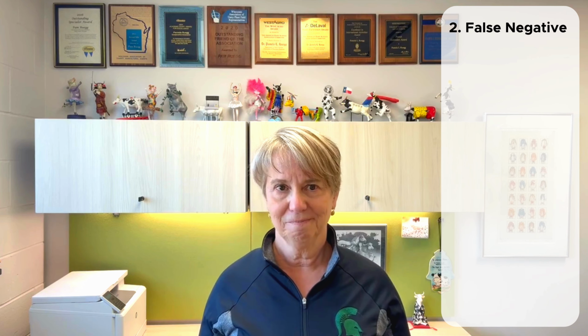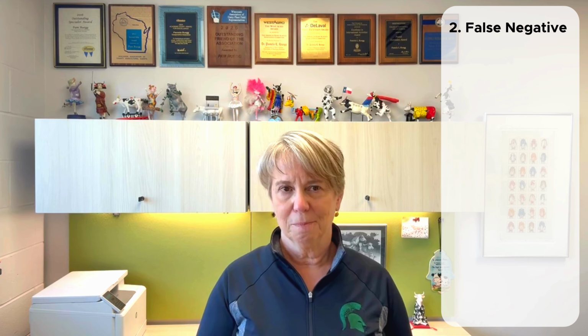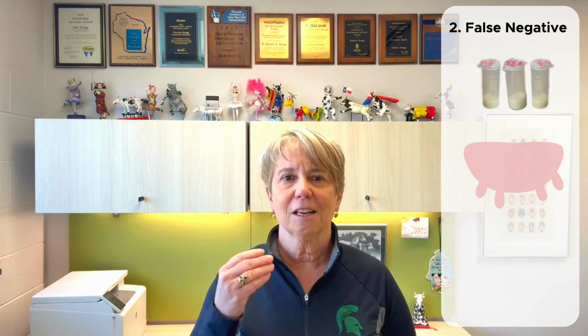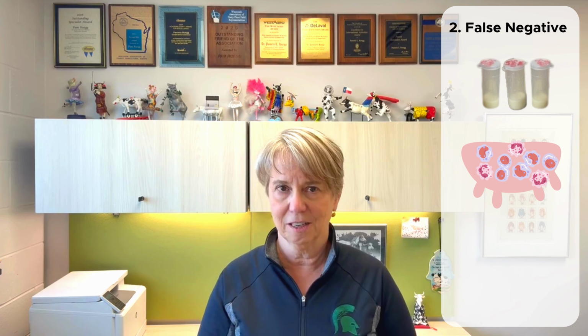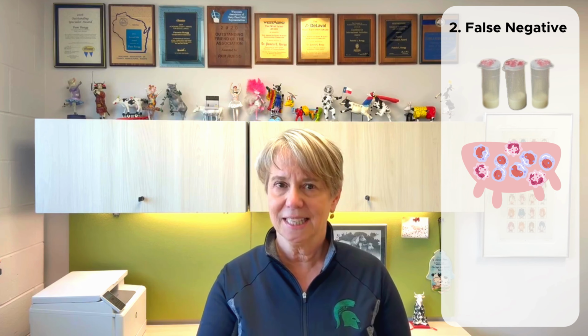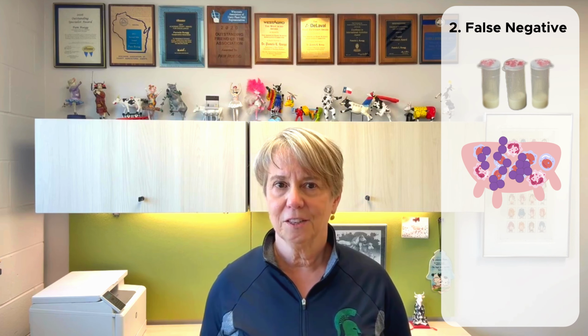The other reason we could get a culture negative result is a false negative result. Now, you got to listen a little bit here because this is a little confusing. Let's say we go to a farm and we take a milk sample from the quarter of a cow that's got a chronically high somatic cell count, meaning there's millions and millions of somatic cells or neutrophils in that udder trying to fight bacteria.